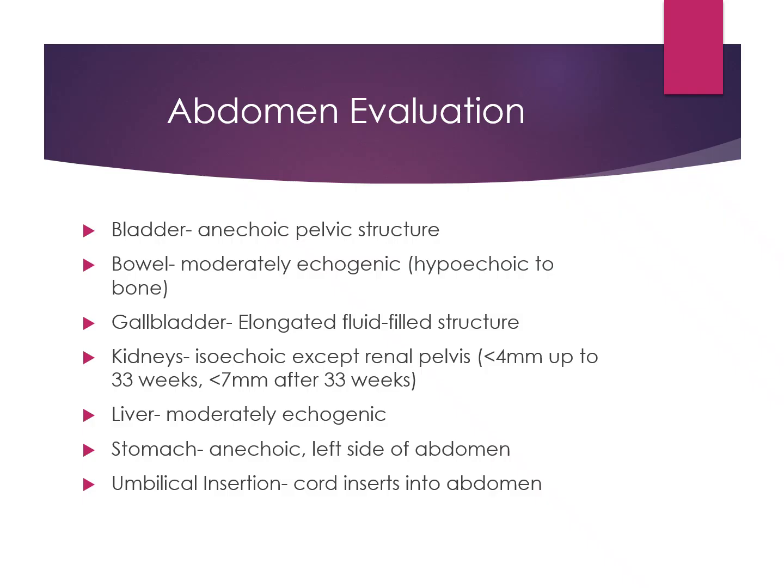This is the tricky one. So you are going to go down until you see that umbilical cord coming out, and you're going to image it there, and then you're going to image the cord itself, and then you're going to image it at the placenta insertion.